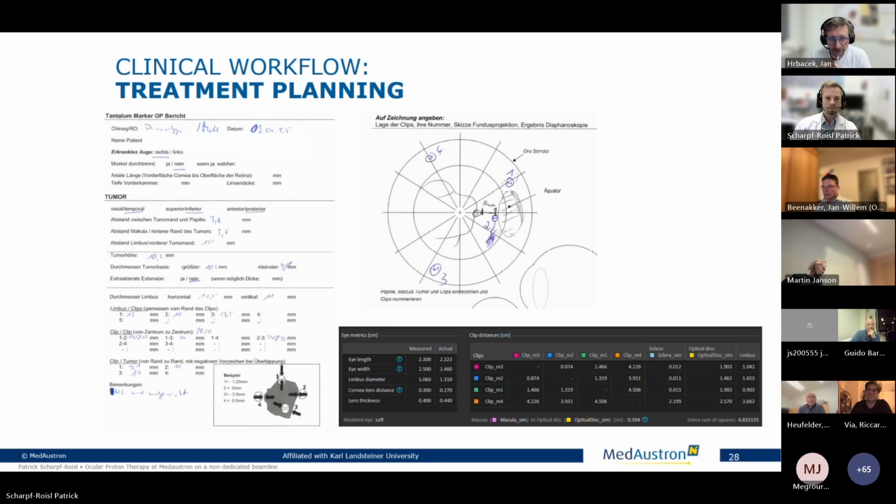Okay. Next question is from Ricardo Villa. Ricardo? Hello, thank you for the presentation. I noticed that you use for planning the MR with the clips on, and yet you have available an MRI without clips. I understand why you do that, but I was wondering if you ever checked. So do you find that an MRI without the artifacts with the clips does not give you any more clinically relevant information than the one with the artifact with clips, or you just didn't check?